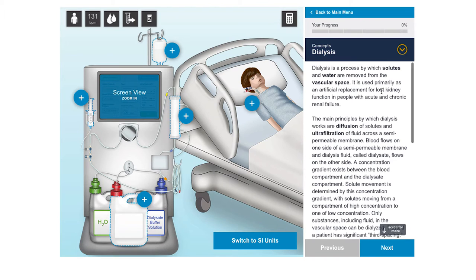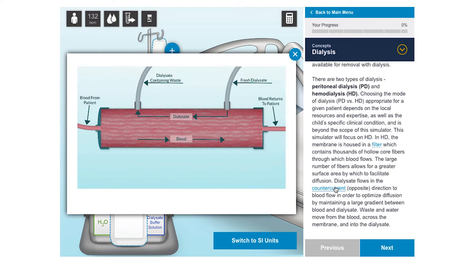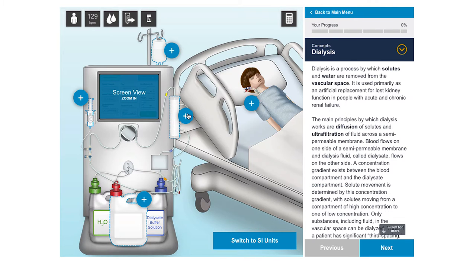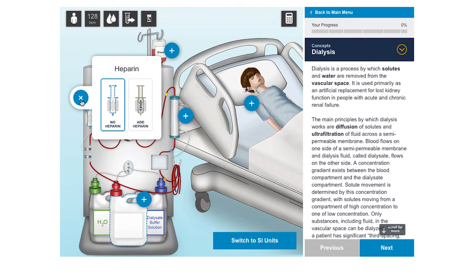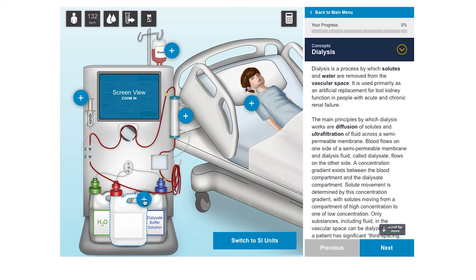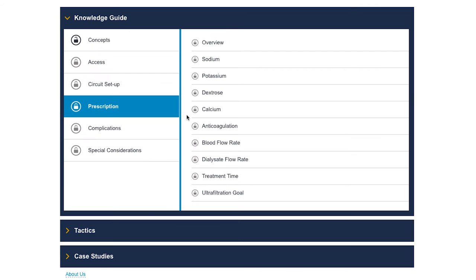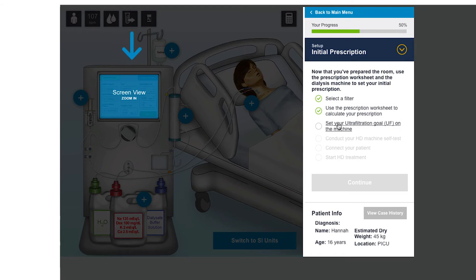In the knowledge guide, the learner is taught the key concepts of hemodialysis through text, illustrations, and short animated videos, which train the learner how to set up a dialysis circuit and calculate a dialysis prescription. These concepts and skills are needed to manage the simulated patients in the following section, and the learner can return to the knowledge guide at any point to review concepts.